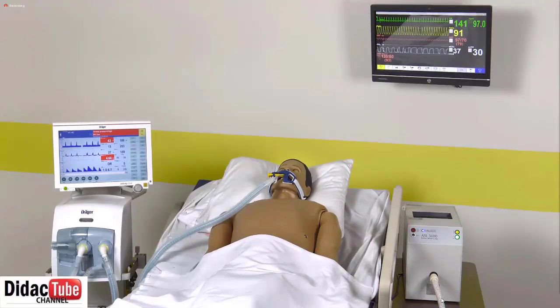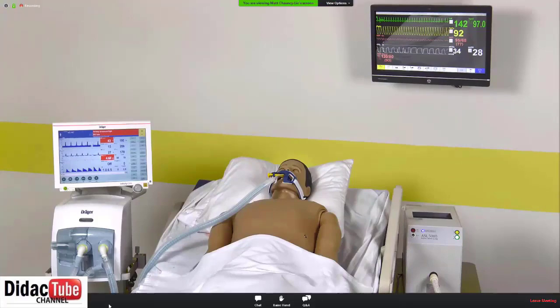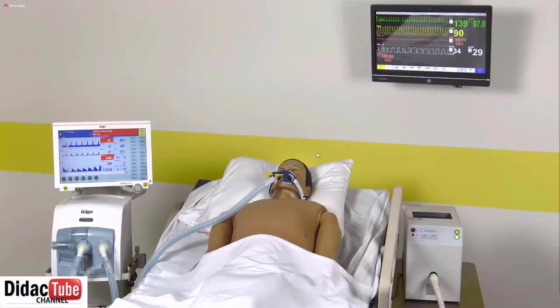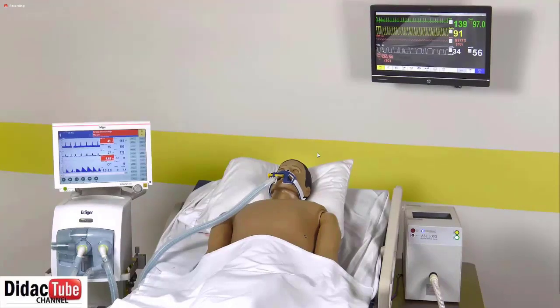So before we jump into the scenario, I would like to quickly introduce the technology that we used to run it. What you see on the screen right now is the ASL5000 lung solution. This solution integrates the world's most realistic breathing simulator, the ASL5000, with the SimMan 3G, SimMan Essential, and the new SimBaby to run scenarios with a spontaneously breathing patient supported on a ventilator.